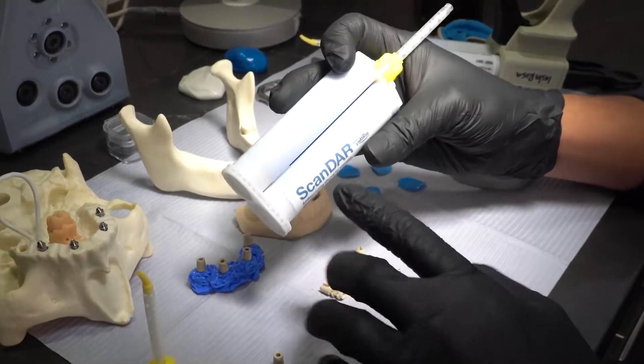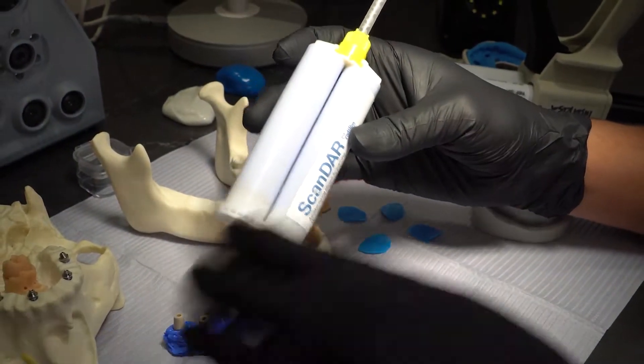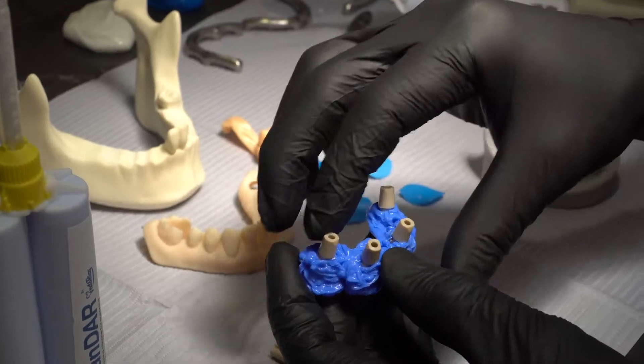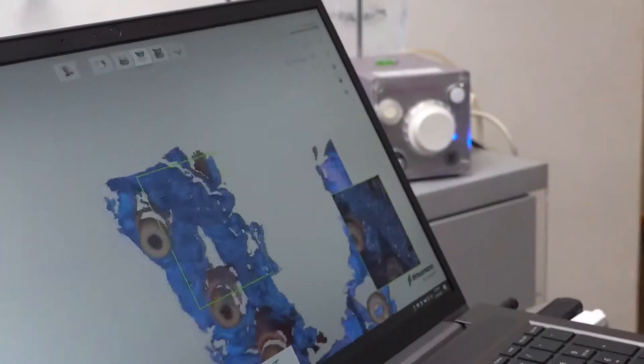Here we have our material, Scandar. It's a very hard material that we utilize and developed to make this possible, because when we scan in the mouth we want to make sure that the material is hard — like teeth — applying scanner all around the scan bodies. Now we can achieve a passive fit restoration for same-day, next-day, or final deliveries.